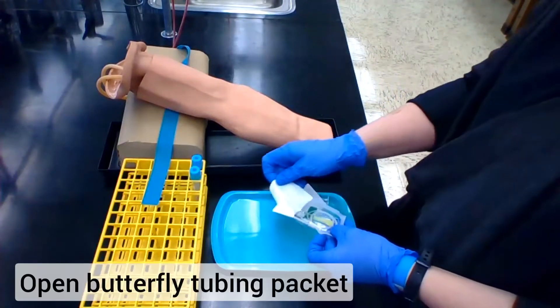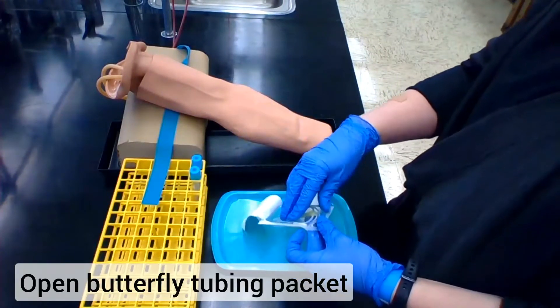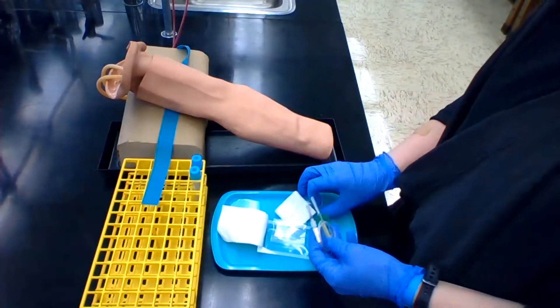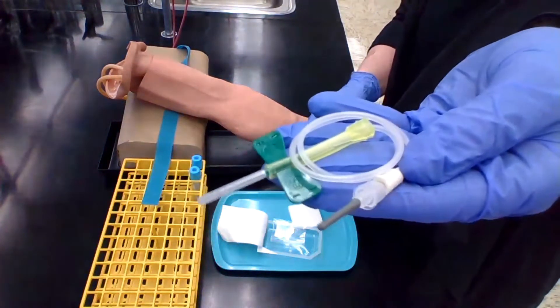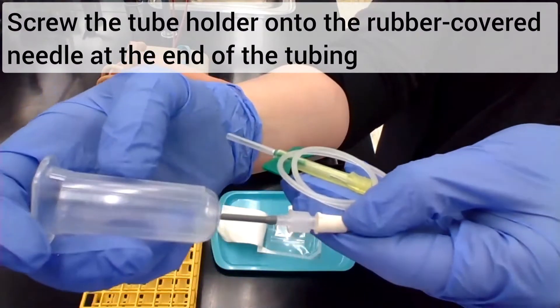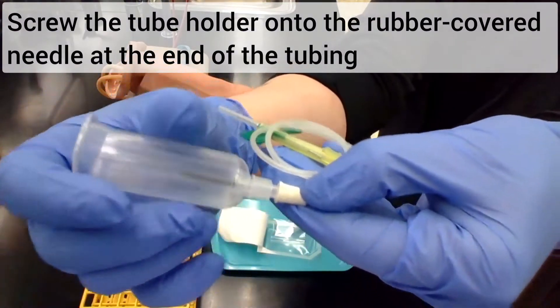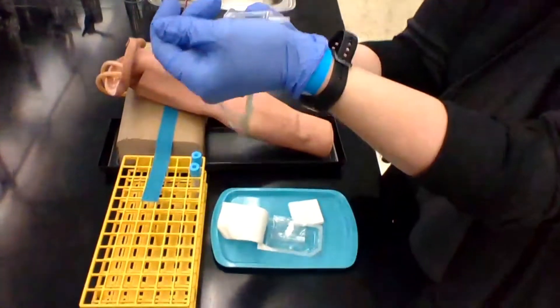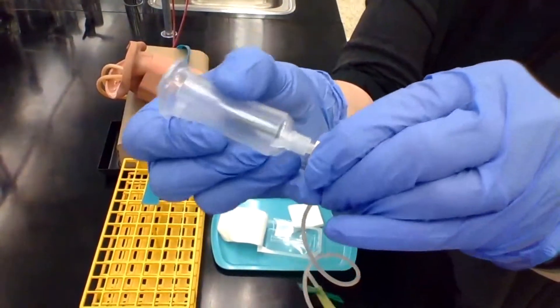The first step is removing the butterfly tubing from the packet. It will come in a little plastic sleeve and you can just remove the tubing from that sleeve. Tightly screw the tube holder on the needle that has the rubber tip at the end of the tubing. You want to make sure that this isn't going to pop off in the middle of your draw.